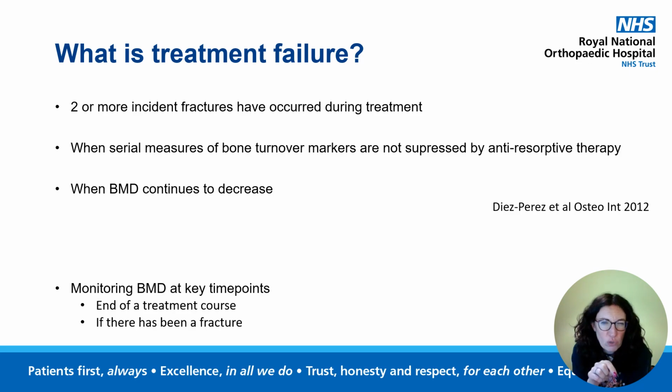And I think in contrast with this Diaz-Perez paper, we would definitely reassess if the patient's had a fracture and they've been on treatment a reasonable amount of time. If they've literally just been on treatment, you probably wouldn't repeat the bone density scan.